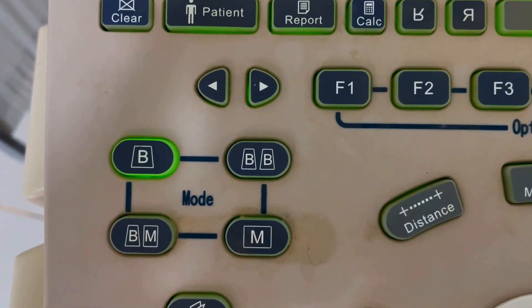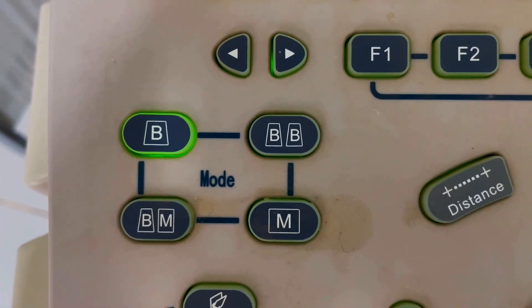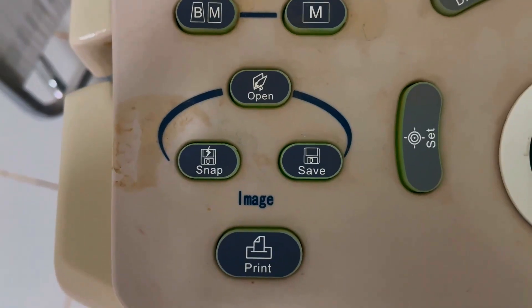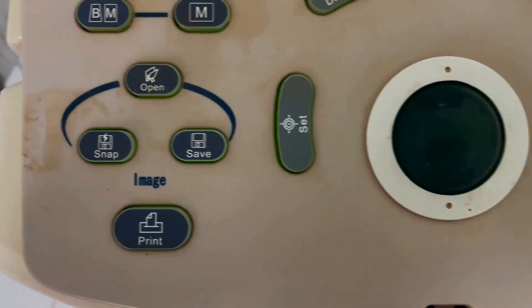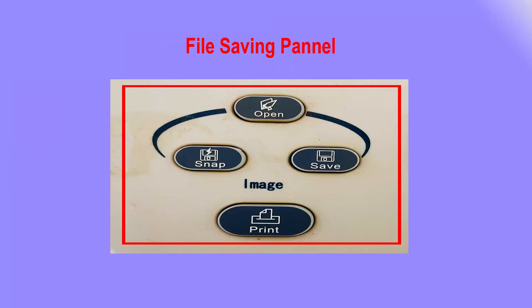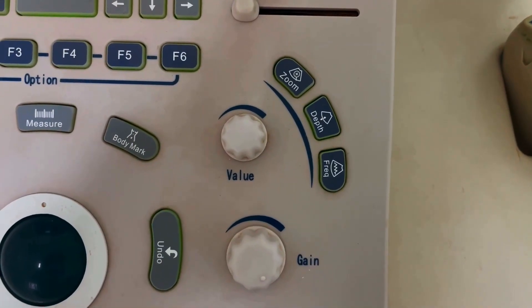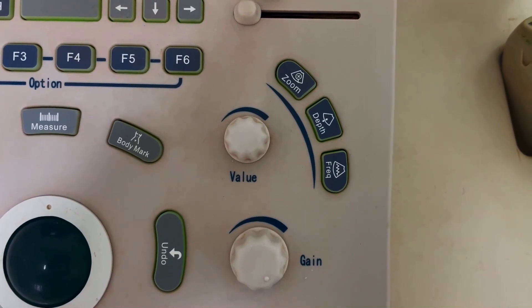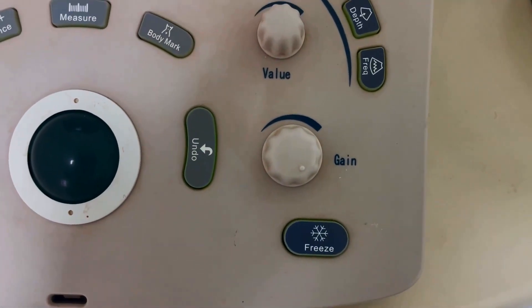This one is the parameter measuring panel. This one is the different view mode panel. This one is the file saving panel. This one is the gain, zoom, depth, and freeze panel.